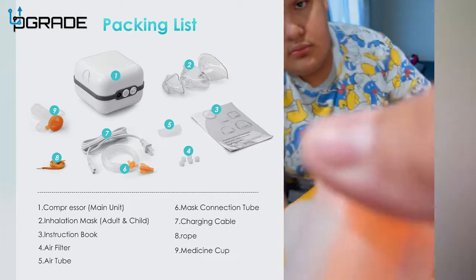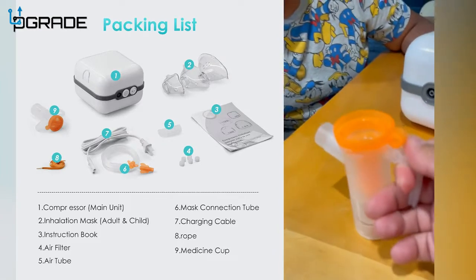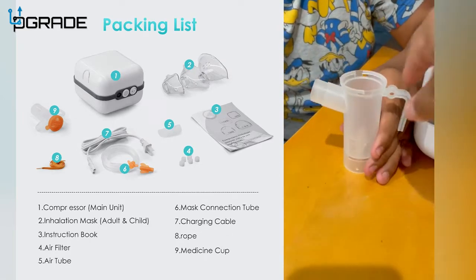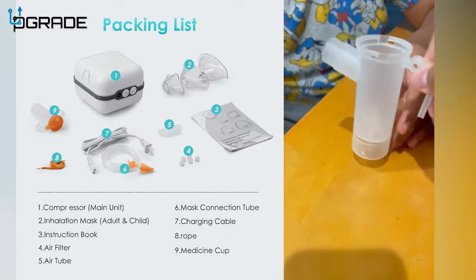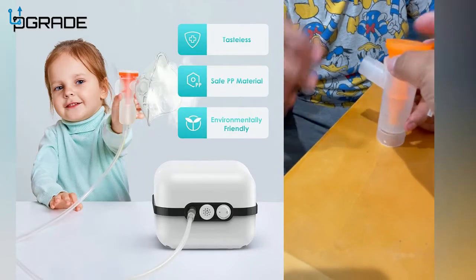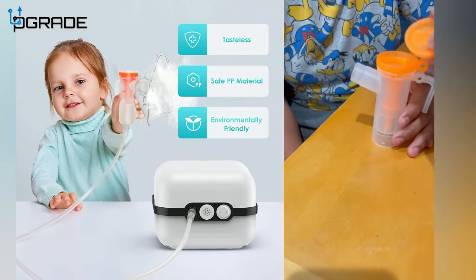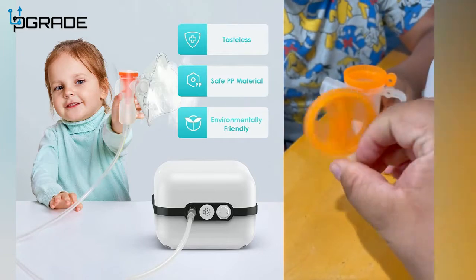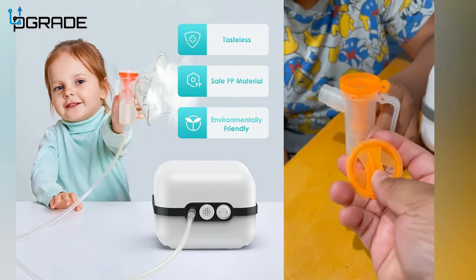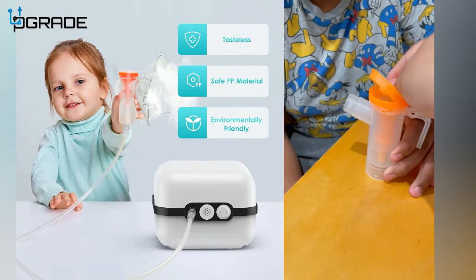I love the way it has a handle — for parents this handle is really awesome. It's also really easy to clean. It comes in two pieces: it has a cover, and the cover slides to one side so you can dispense the medicine into it. You put the medicine in there and then close it.